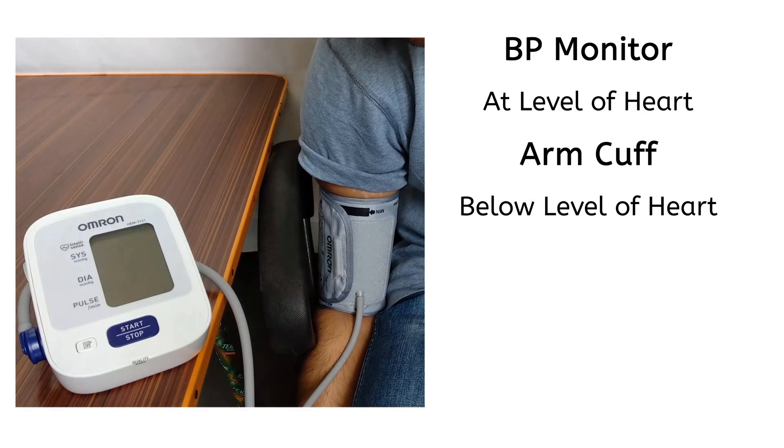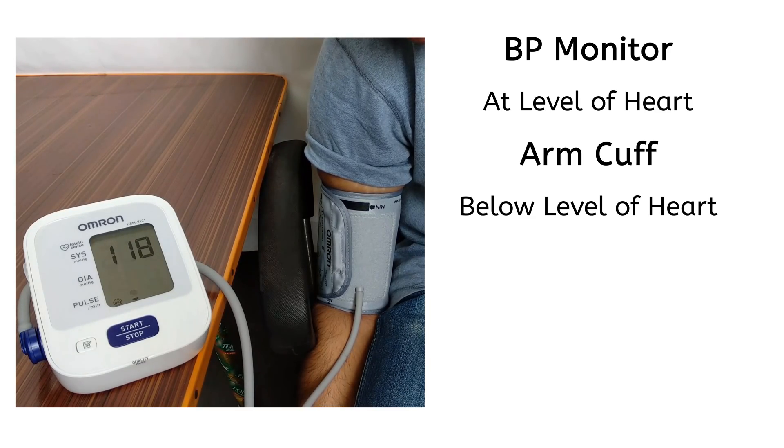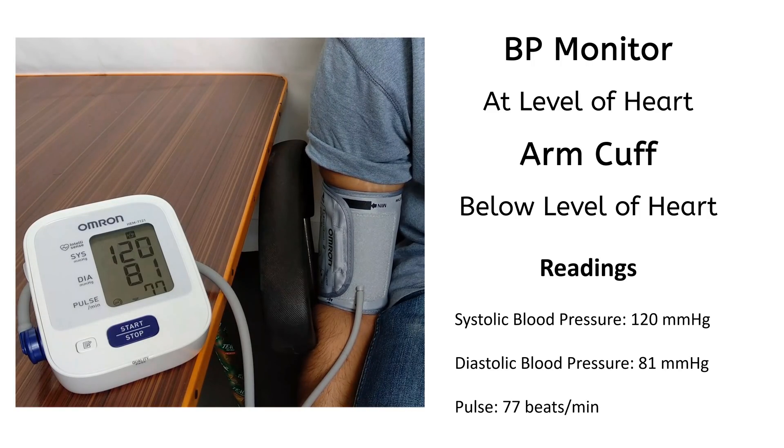This position is with BP monitor at the level of heart and the arm cuff below the level of heart. These are the readings on the monitor.